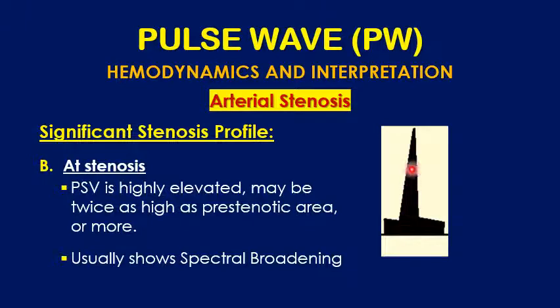What happens here? I get this high velocity. Be careful here, you might get aliasing. So you need to adjust the velocity scale. You increase it as much as possible to avoid aliasing of the artery here.